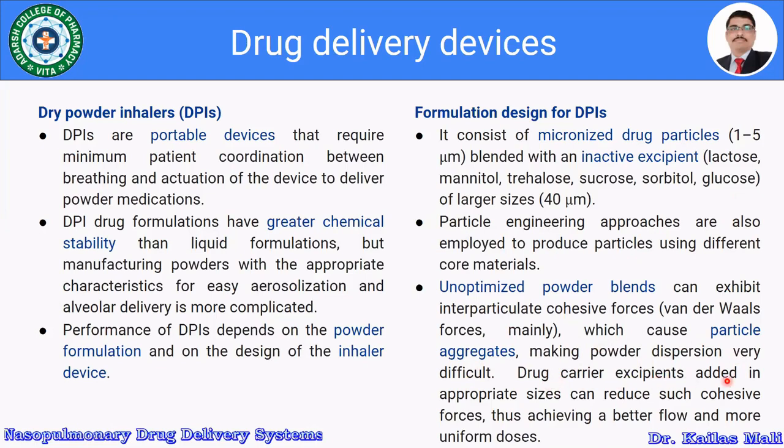Drug carrier excipients are added in the appropriate size, which can reduce such cohesive forces, thereby preventing aggregation and promoting flow properties, and we also get good uniformity in the dose.